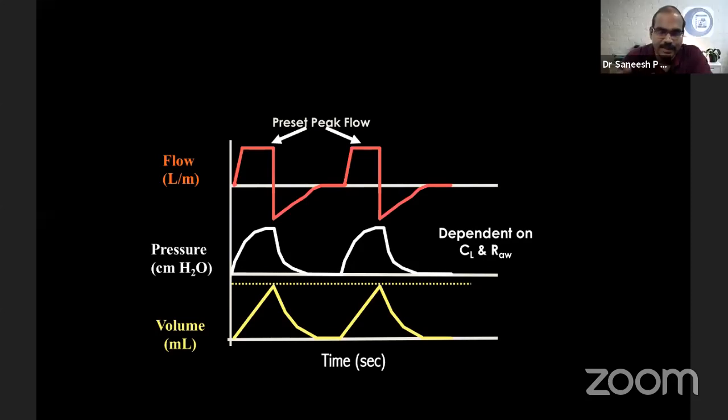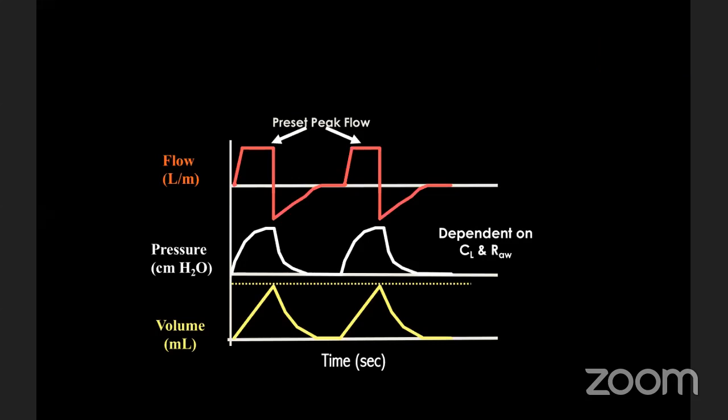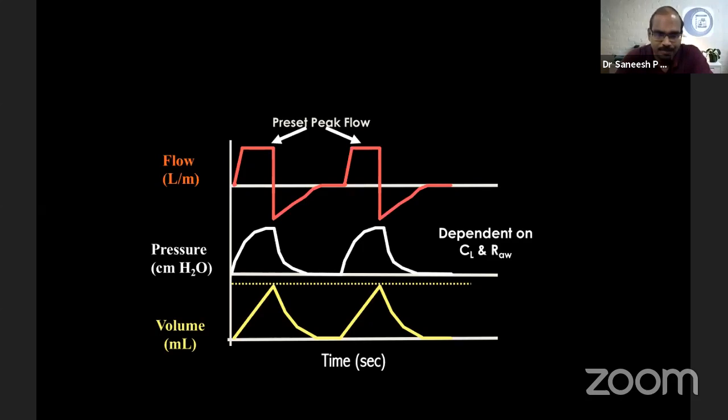When you are doing the troubleshooting, make sure that you look at the patient, circuit, or ventilator. If there is any circuit kinking or ET tube kinking, this trans airway resistance will be more. So you have to make sure that there is no kinking. Look at the best possibility. You auscultate the chest. If there are any audible wheezes, then you institute bronchodilators. So troubleshooting includes a comprehensive view. You cannot ignore the machine, you cannot ignore the patient, and the in-between interface circuit also.